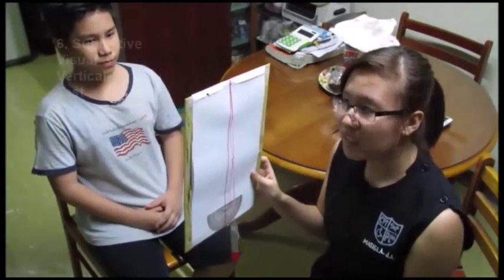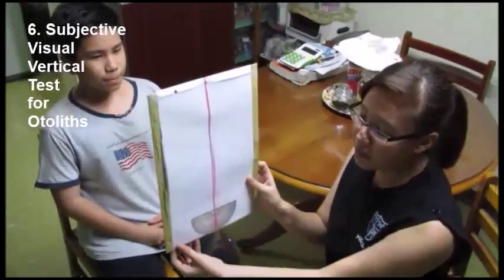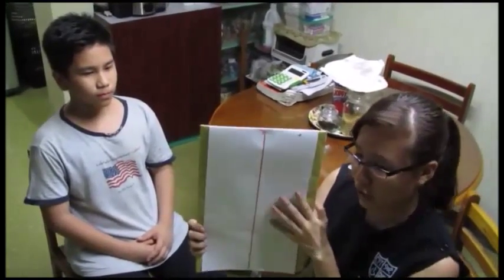We will be performing the subjective visual test to assess the integrity of the otoliths. Here is my SVV test device, and this is the side where I will be utilizing, and this is the side which will be used by the patient. So in performing this test, supposedly it's done in a dim lit room. But for purposes of demonstration, presume that we're doing this in a dimly lit room.